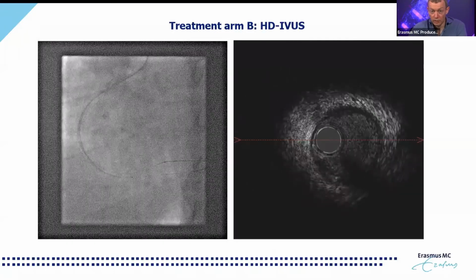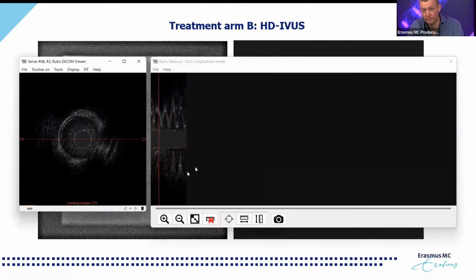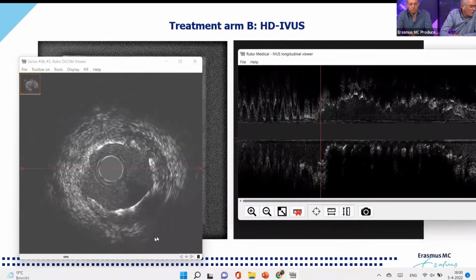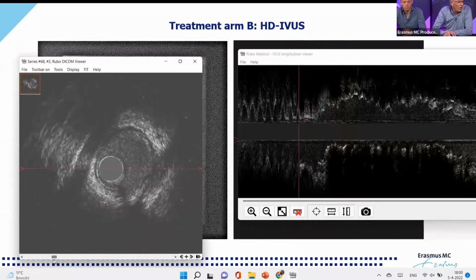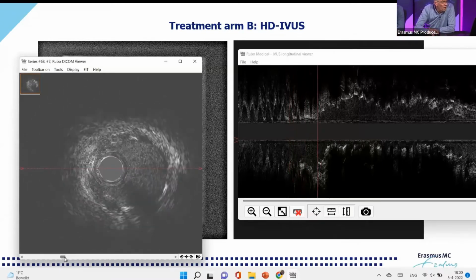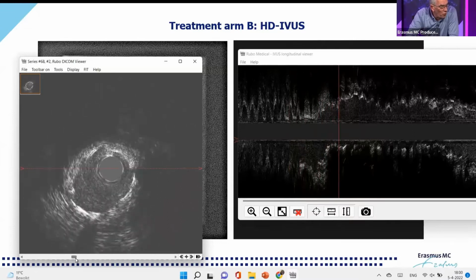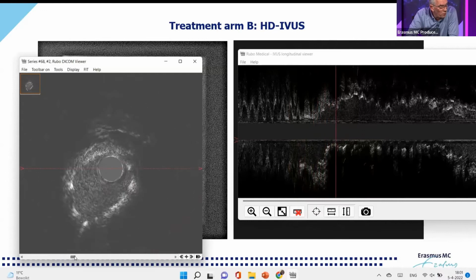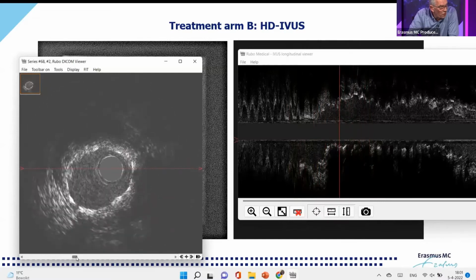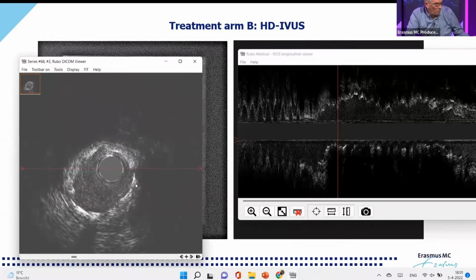So with that, we continued with the IVUS in order to get a better appreciation of the type of disease and to see if we were able to identify a focal target to allow post-PCI optimization. Well, then we started in the distal right coronary artery, where what you can appreciate is a normal vessel here. So then here we reach the old stent, and what you see here is that the old stent is underdeployed. If you compare it with the distal deployment here, it's underdeployed, comparing to the proximal reference. Definitely, I'm going to measure this for you. We're going to make a measurement in here.